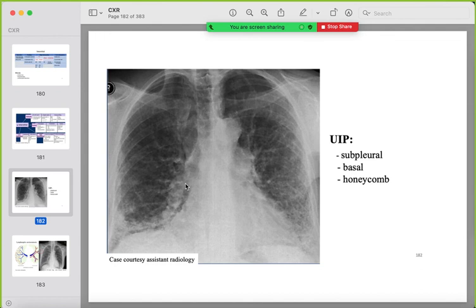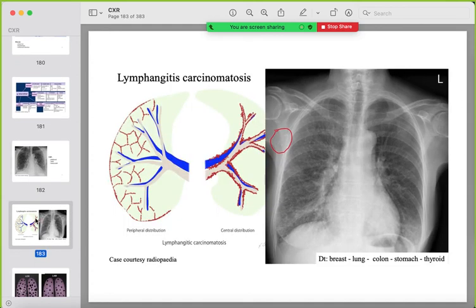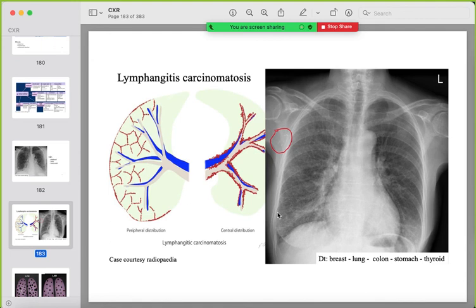Example of usual interstitial pneumonia (UIP): reticular changes more in the lower lung zones, reaching the pleura. Lymphangitis carcinomatosis (seen earlier in the mass section): reticular changes reaching the pleura, with surgical clips in the axilla indicating previous breast cancer, more prominent on the right side.